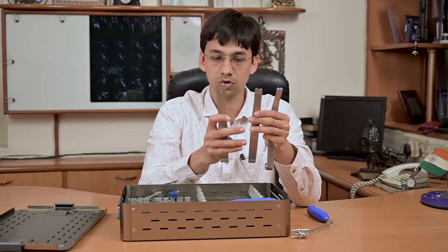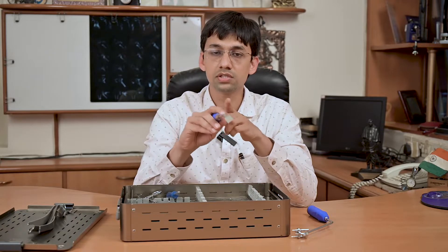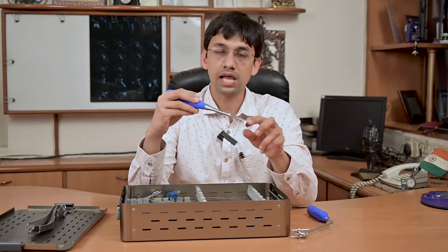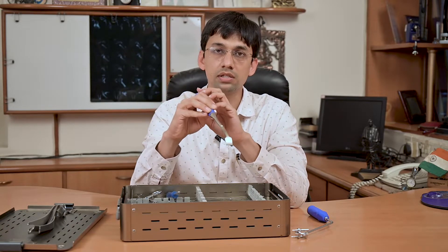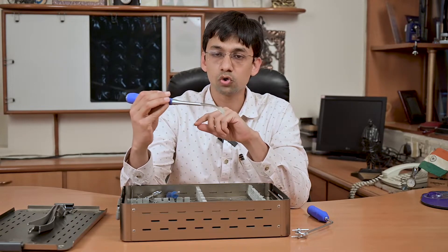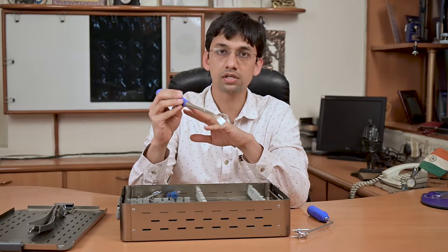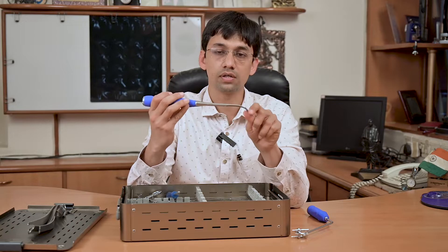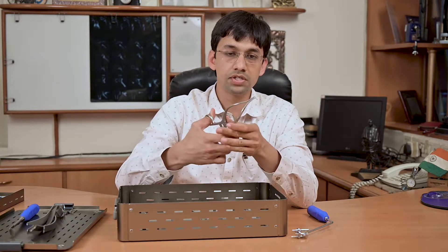Depending on the size of the patient and the requirement of retraction, we can use these three different sizes of glenoid retractors. For coracoid process osteotomy, we have this curved osteotome with sharp edges, angled such that we don't need any other angled osteotome. From medial to lateral, we can do the osteotomy with gentle taps. This osteotome has around 60 degrees of angle.